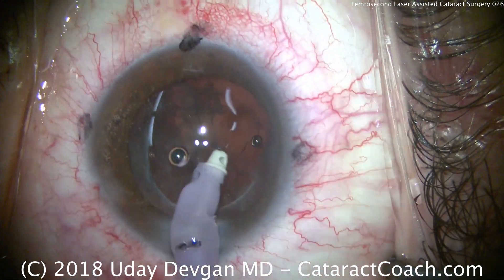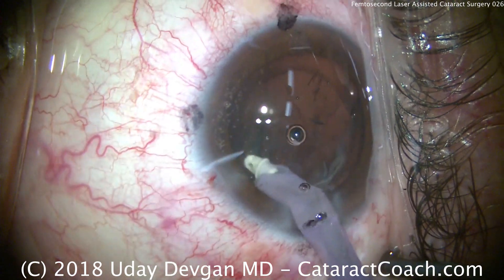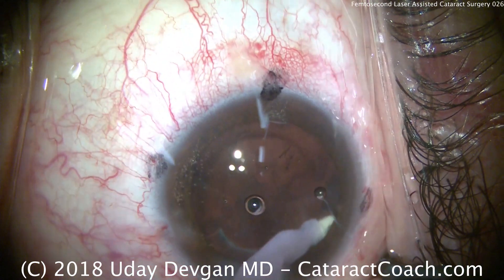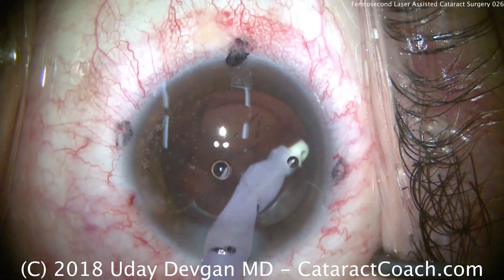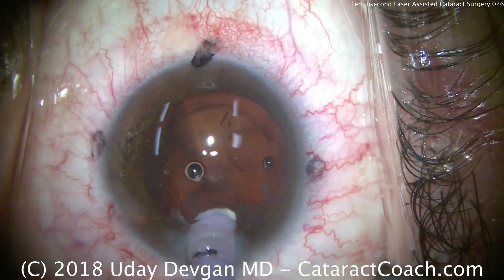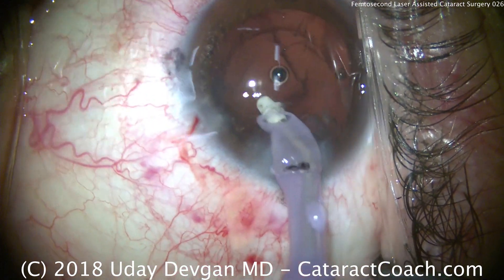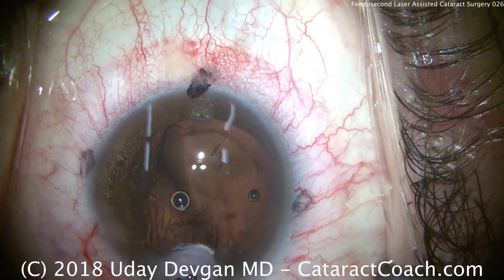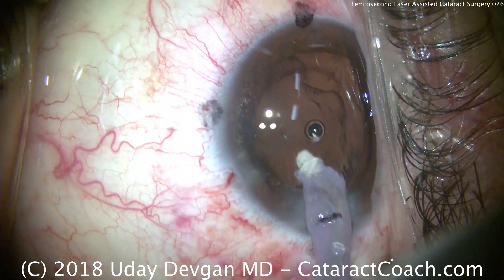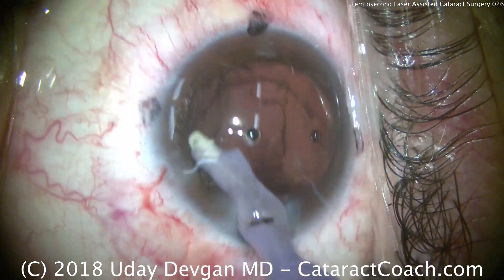So was there a big benefit in this case to using the femtosecond laser? Not really. It didn't decrease phaco energy appreciably. We could have chopped the nucleus with the chopper instead of having the laser subdivide it. An expert surgeon can certainly create a very consistent capsulotomy greater than 99% of the time. In this case, we used the femtosecond laser for patient preference — this patient had heard about it and was very much in favor of having it used on her eyes, so we obliged.